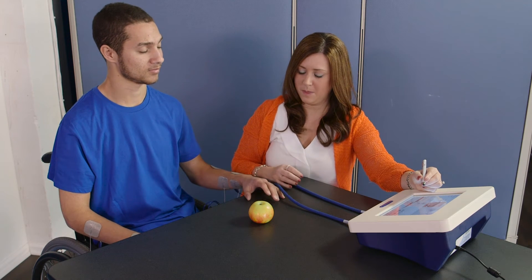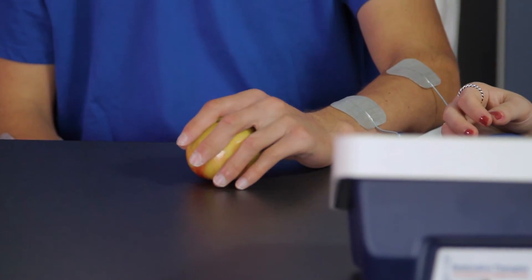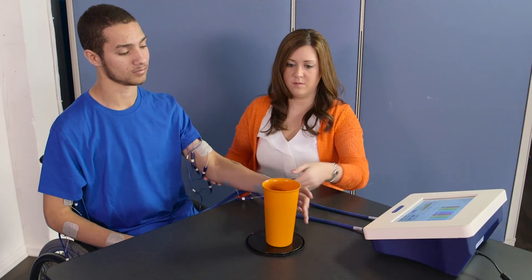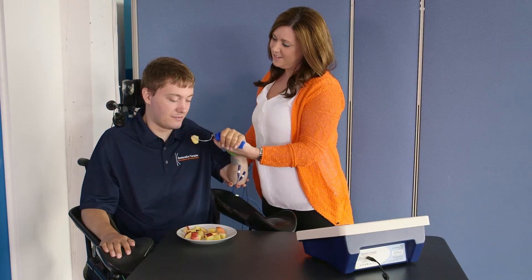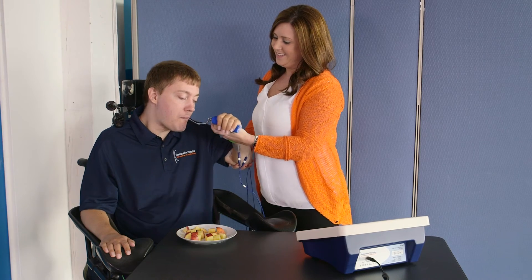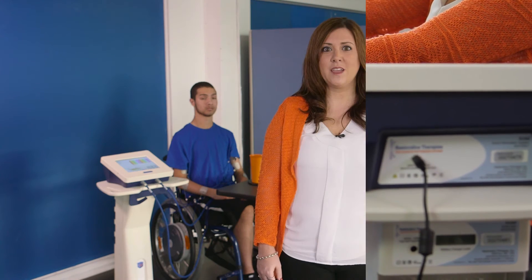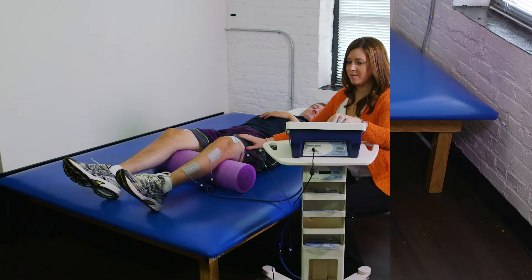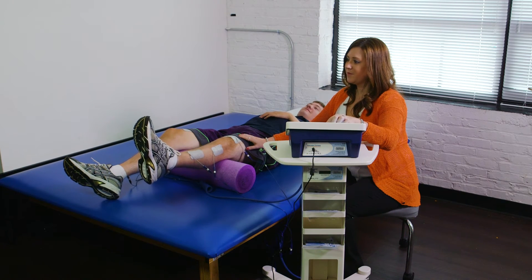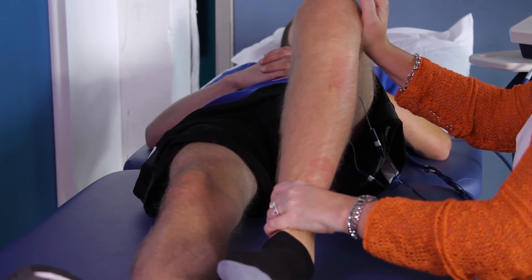The upper extremity library has therapy programs for activities including grasp and release, forward reach grasp and retract, hand to mouth, upper extremity weight bearing, and many others. The lower extremity library has therapy programs for activities including long and short arc quads, sit to stand, heel slides, and many others.